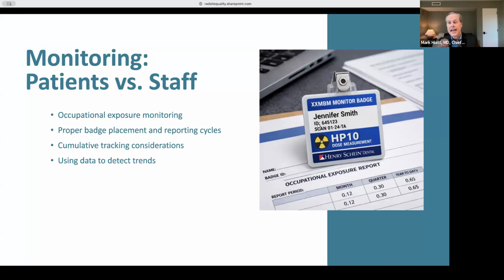Now, the staff member wearing that dosimeter or badge should, in order to accurately record the impact on their body, wear it as close to their body as possible, right? Underneath the shield. In most cases that I've seen, they're not wearing lead aprons when they're doing their X-rays. I have not seen a person wear one. It could be the states that I live in. So my point is, contrary to what I was saying, you shouldn't protect that badge. Rather, you should leave it out in the open so that it can accurately record the radiation in your environment that you potentially could be exposed to.